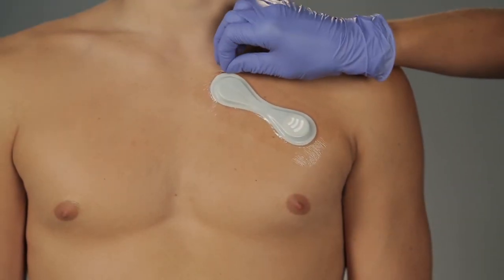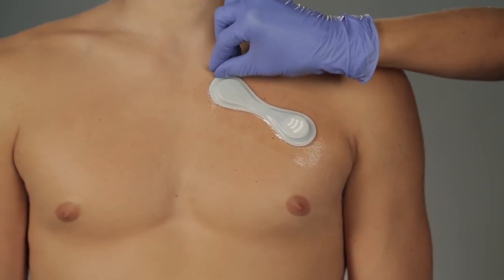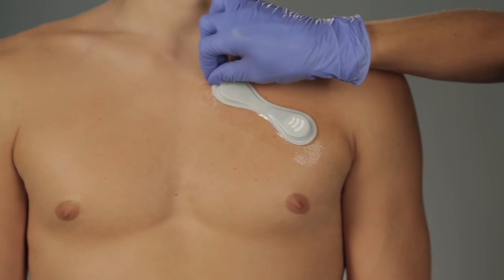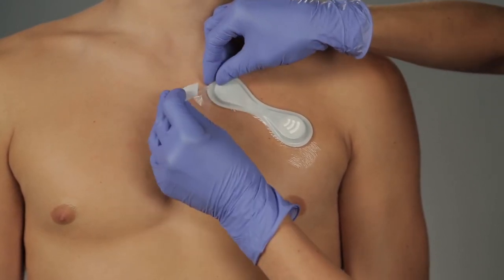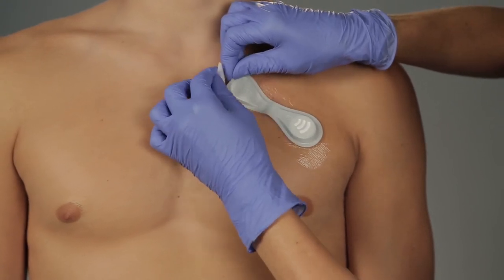To remove, start from one side or corner. Gently stretch the overlay away from the skin. The biosensor may remain attached to the overlay. Use an adhesive remover as needed.